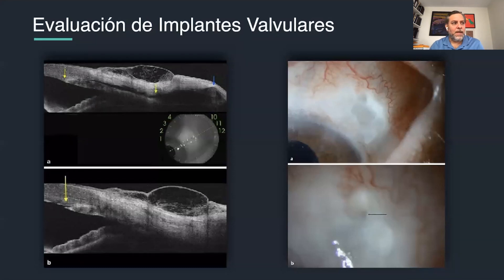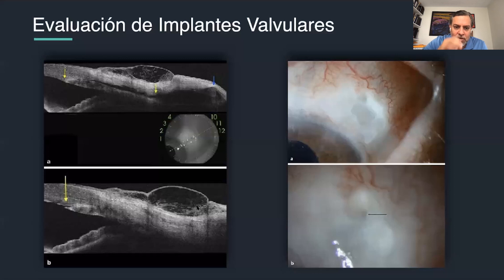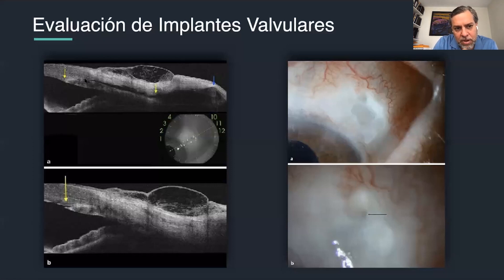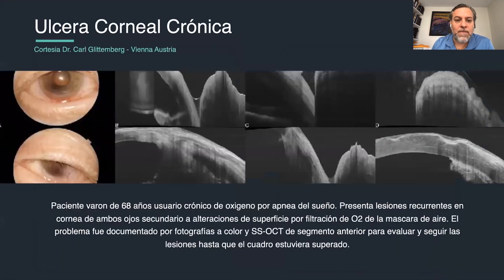For glaucoma evaluation, OCT can assess various surgical implants. You can monitor bleb morphology, detect changes in density from fibrin reactions, identify fistula formation, visualize the incision track into the anterior chamber, and observe the lumen of a drainage valve to determine whether it is functioning well or has stopped filtering.